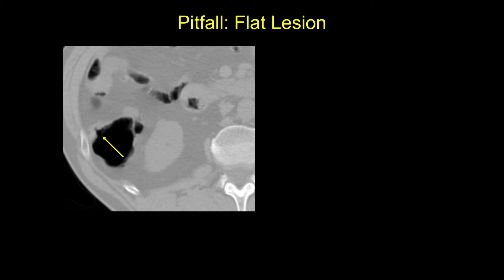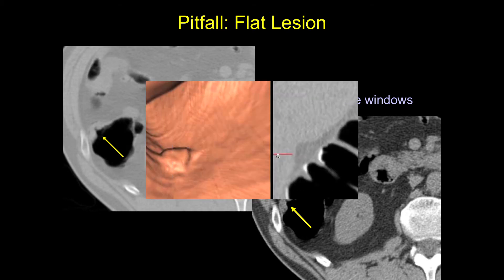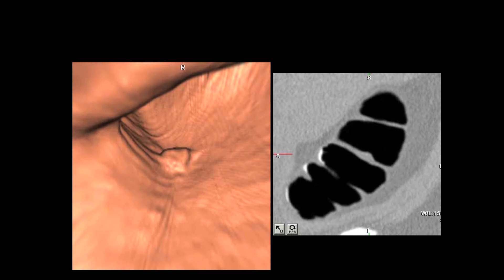Flat lesions are tough for CTC — they're tough for colonoscopy as well. One of the key teaching points here is to make sure that you use your soft tissue windows, because they're actually much easier to identify using soft tissue windows. Here's another lesion that's actually easier to identify on the 3D. When you look on the 2D view, it's fairly flat — the definition is that it's less than 3 millimeters in height. You can imagine that if you're scrolling too fast, you would scroll right by this.